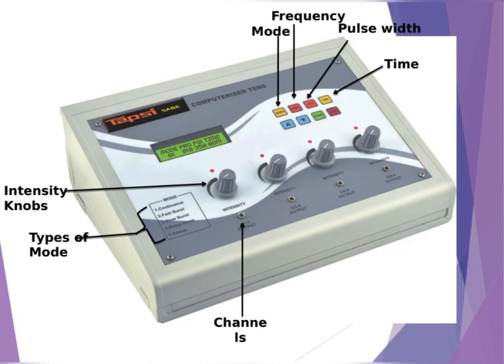This is a 4-channel TENS machine. These are the 4 intensity knobs. These channels are connected with leads and electrodes which are further placed on the patient. This is the mode button to change the mode like low, high, brief, burst and modulated TENS. This is the frequency button used to vary the frequency according to the mode. This is the pulse width button. And this is the time button.